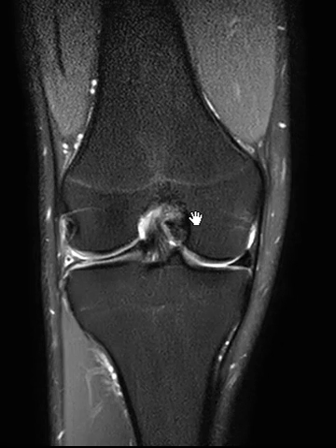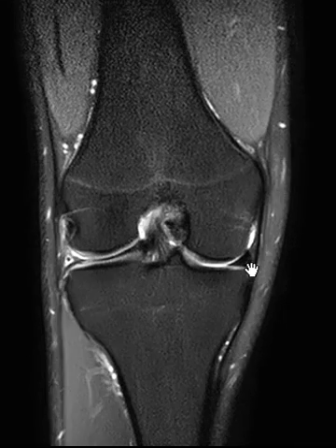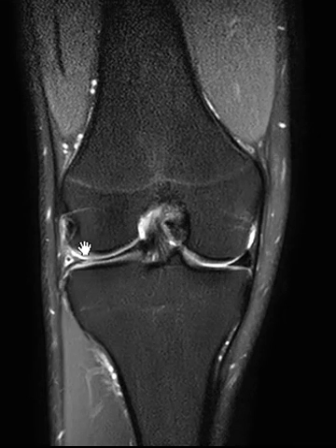On this view, we're looking through the knee. We can see the medial side of the knee joint here — looks good. You see a nice, beautiful, sharp meniscus that looks like a perfect triangle. Now we're looking for the mirror image on the lateral side, and we see the problem.